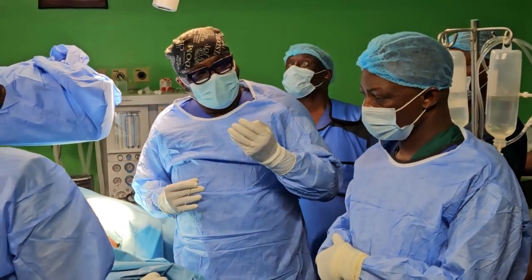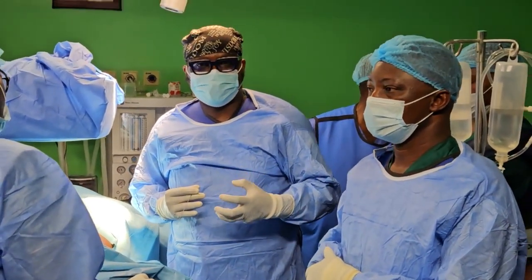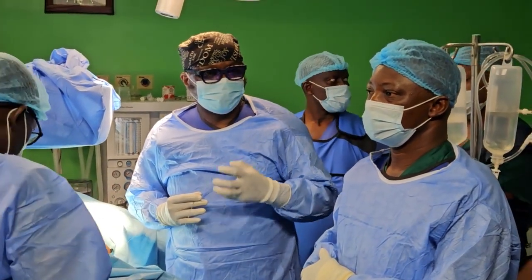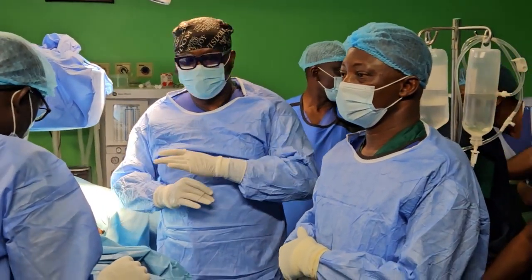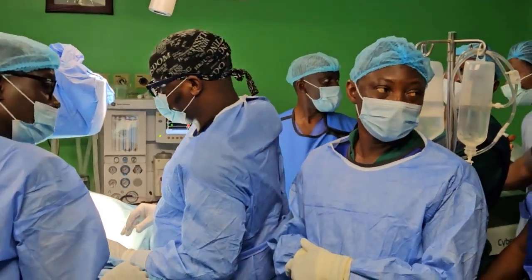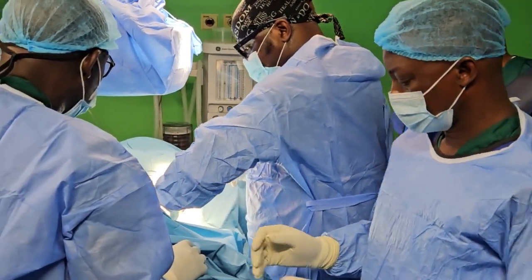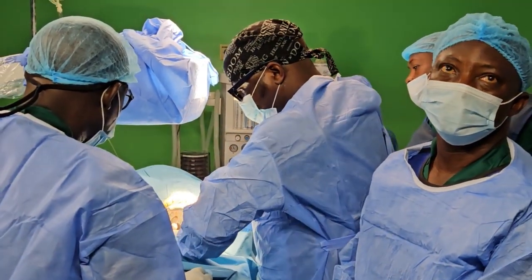So you should add point of care ultrasound to your armamentarium as a urologist. It will be very beneficial to you in so many ways. I think Oga wanted to make a point. Yeah, no, just before you puncture this, some of these explanations can go on as we proceed.